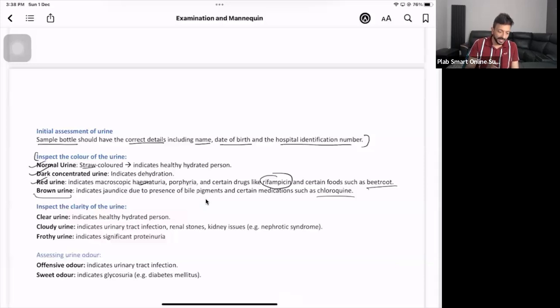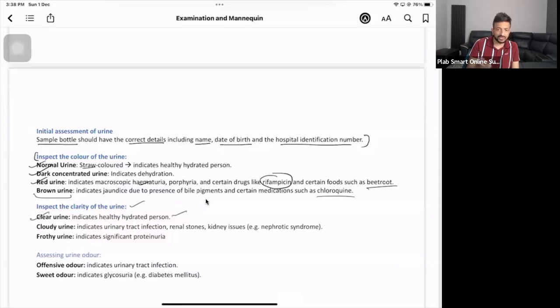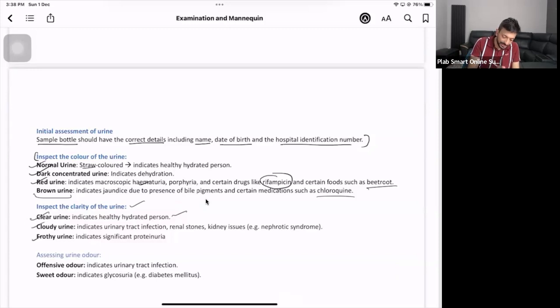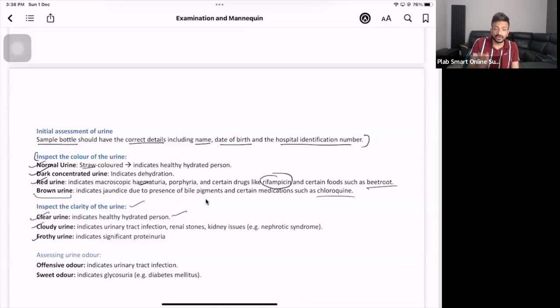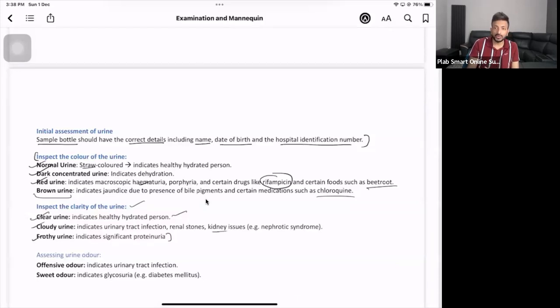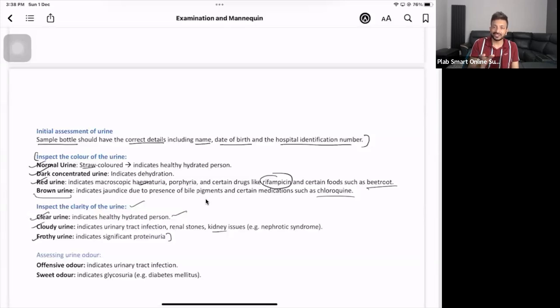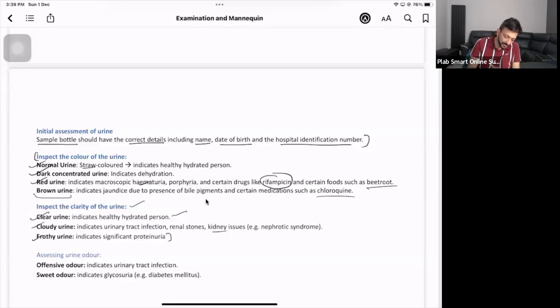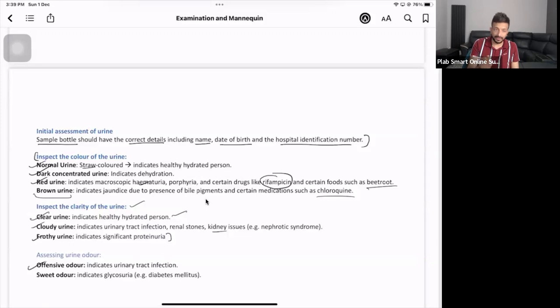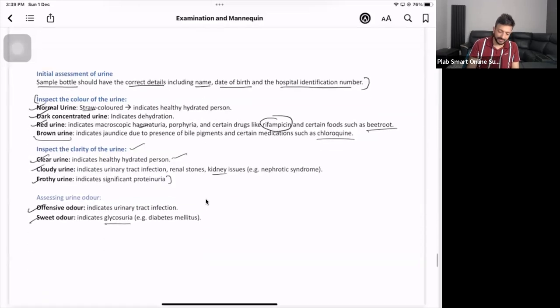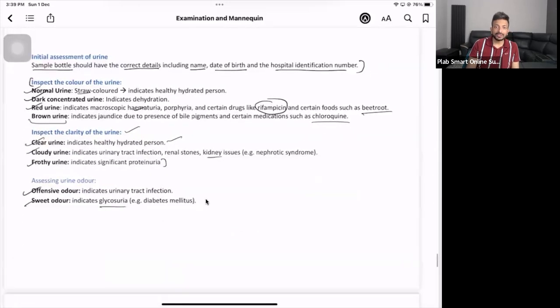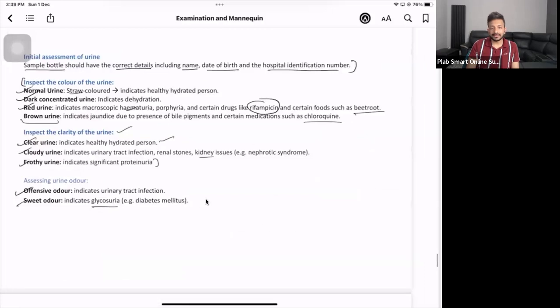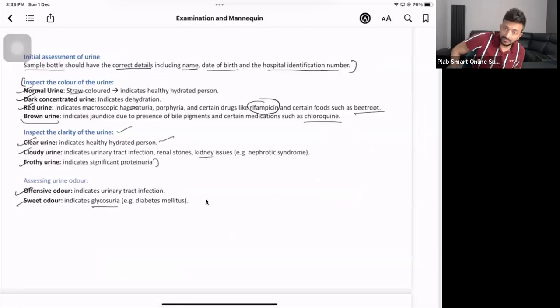Then inspect the clarity. Clear urine means normal healthy person. Cloudy urine means the patient has urinary tract infection or might have kidney issues. Frothy urine means the patient might have protein in it. Then smell - from a distance, don't sniff it. If it's offensive odor, it means urinary tract infection. If it's sweet odor, it might be diabetes or glycosuria.